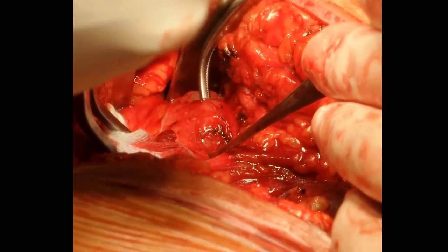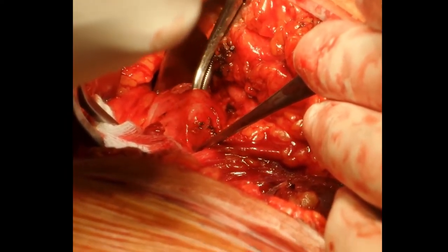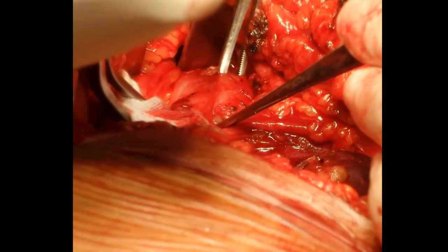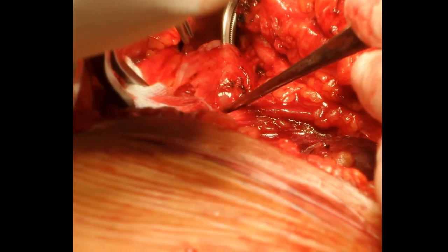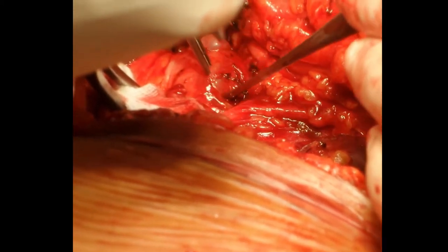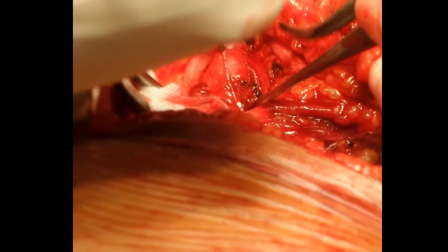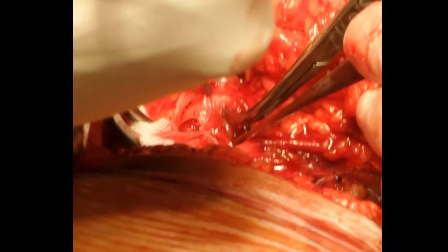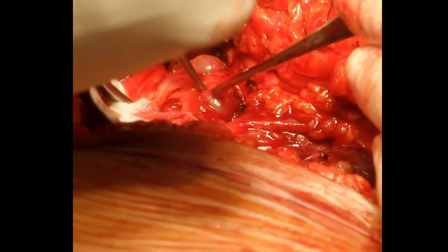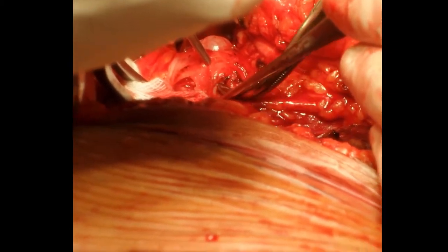This shows the detrusor tunnel being developed. At the proximal and distal ends of it, the bladder mucosa can be seen popping, whilst the bladder is moderately filled with saline to facilitate dissection.